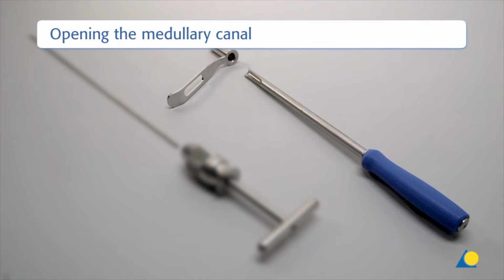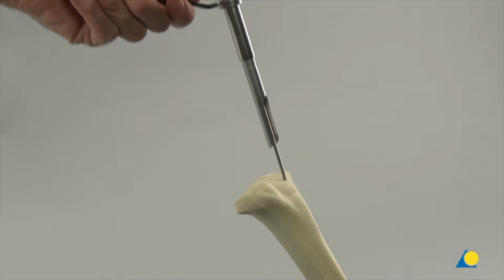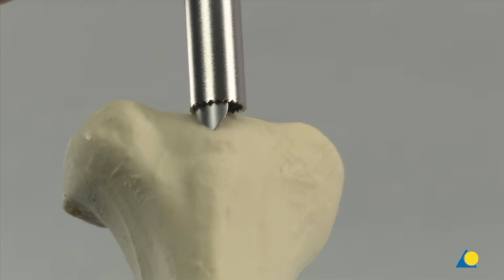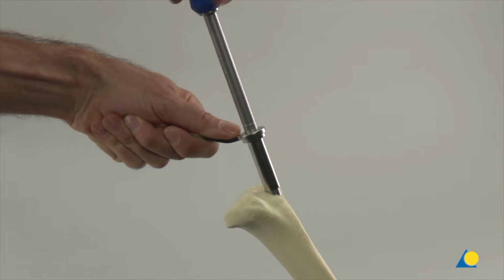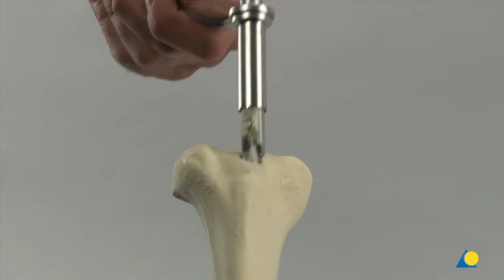The instruments used to open the medullary canal are the cutter for tibial nail, 12.0 mm diameter, and the protection sleeve, 14.0, 12.0. The protection sleeve and the cutter are slid over the guide wire, and the medullary canal is opened to a depth of 8 to 10 centimeters. The guide wire and cutter should not touch the posterior cortex. The guide wire, cutter, and protection sleeve are removed.